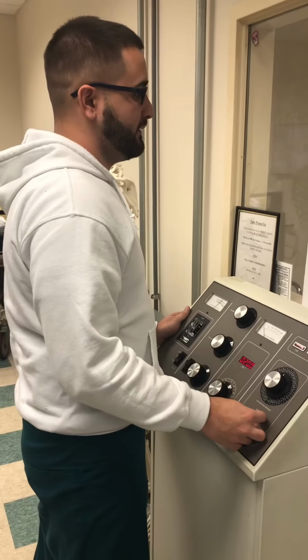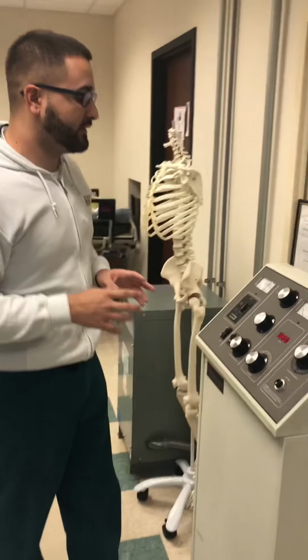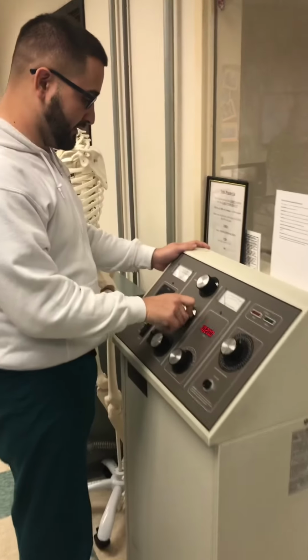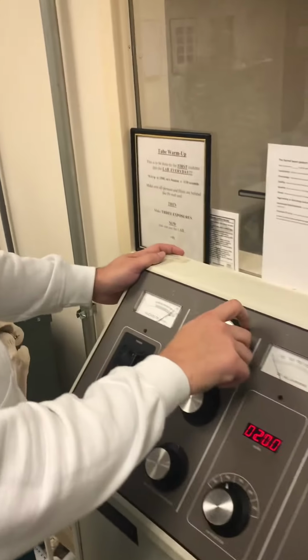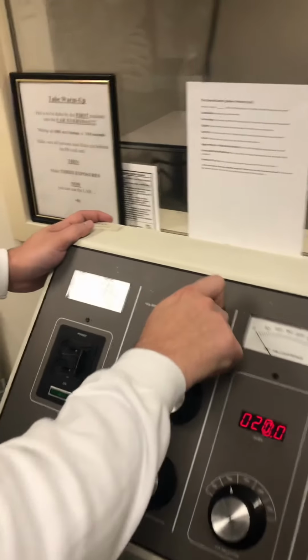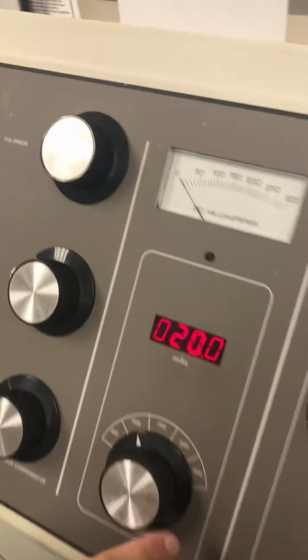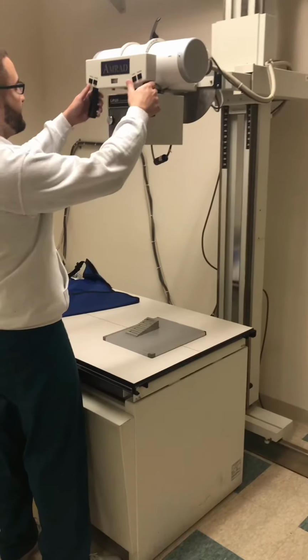X-ray. Now we're going to use a higher kVp because it's going to have lower contrast. So I'm going to up the kVp to 120. We have 120 there, and we're going to keep the mAs the same. So we're going to position it to the other side.